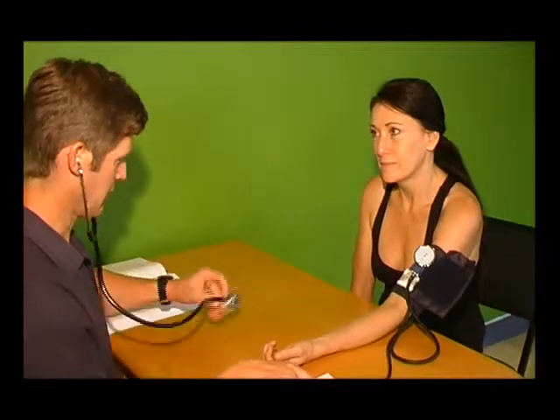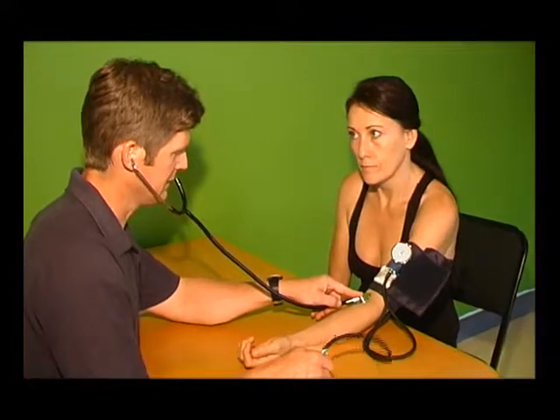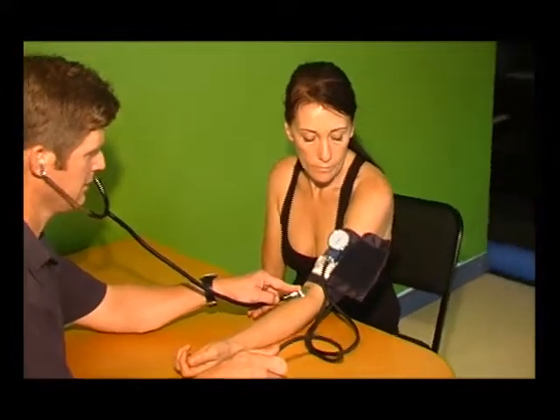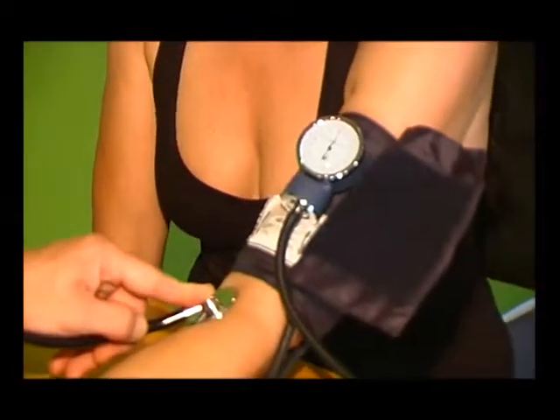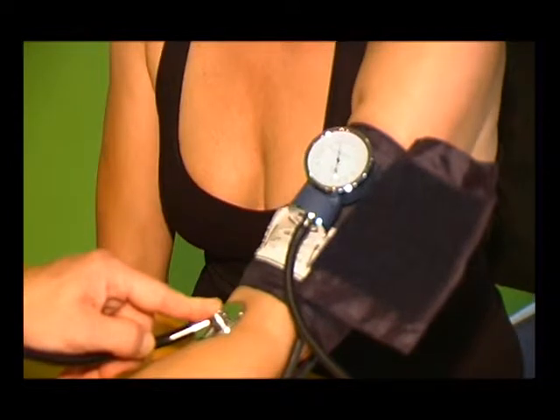Pump the bulb until the gauge reads approximately 160 mmHg. Then open the bulb and release the air slowly. At the same time, watch the gauge and listen for the first beat sound. This first sound is the systolic pressure. Position the stethoscope accordingly.